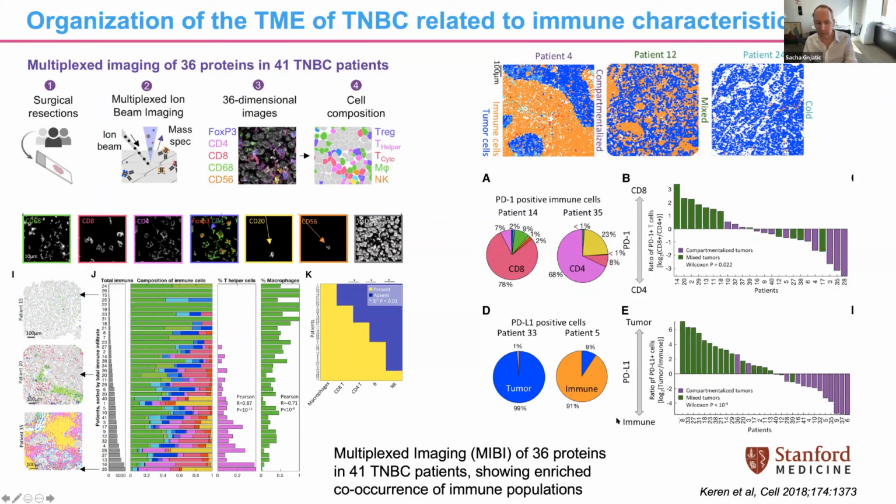And so this is a paper that the Stanford group produced, showing that they can, in these breast cancer tissues, see a variety now of different immune cells. And so right now we're in discussions. They've been generating the validation document to make sure that this can be used now as part of a clinical trial. It's a little bit slower throughput and more complicated to implement because of pre-analytical variables that are required for these tissues to be analyzed.